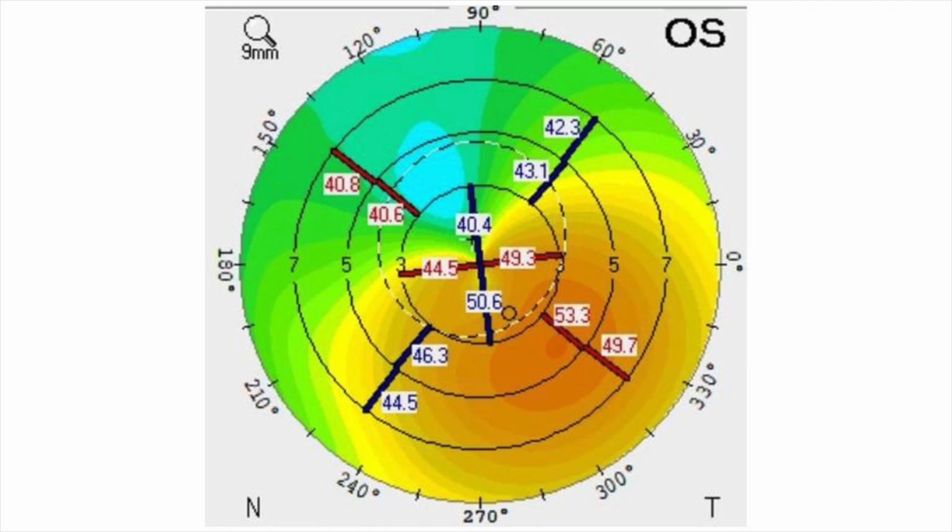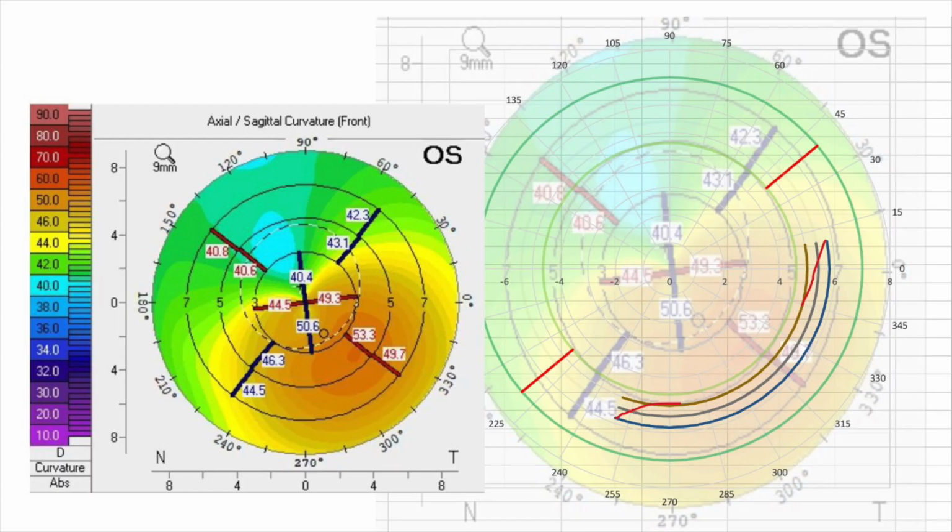So a very similar concept here being demonstrated. I've tapered the end of my CAIRS segment so that I get less of a flattening effect towards the end of the CAIRS ring segment and more towards the center of the CAIRS ring segment.